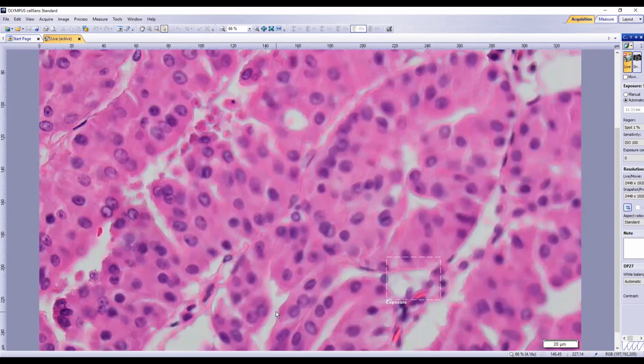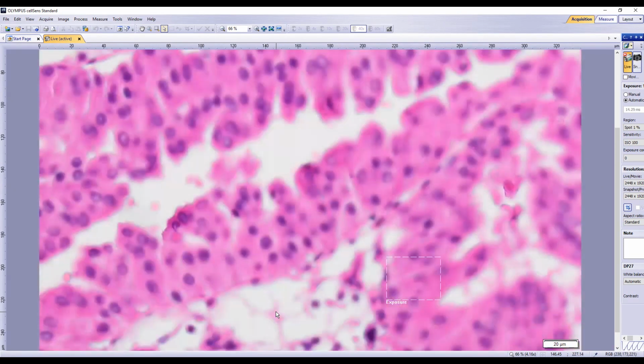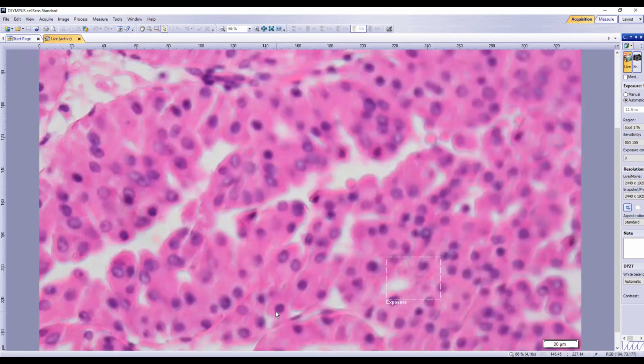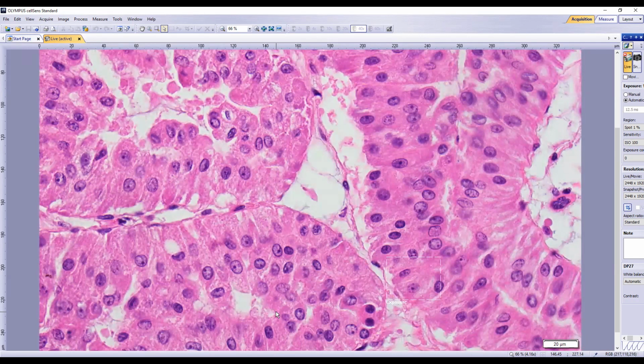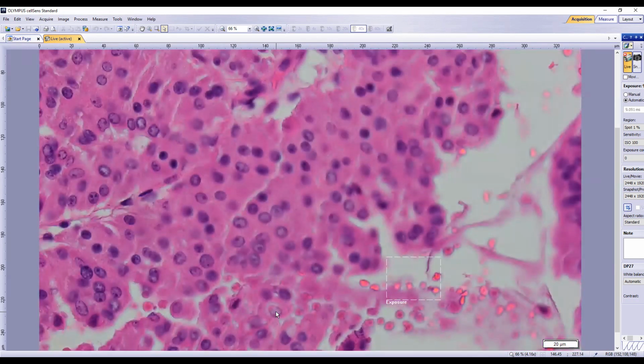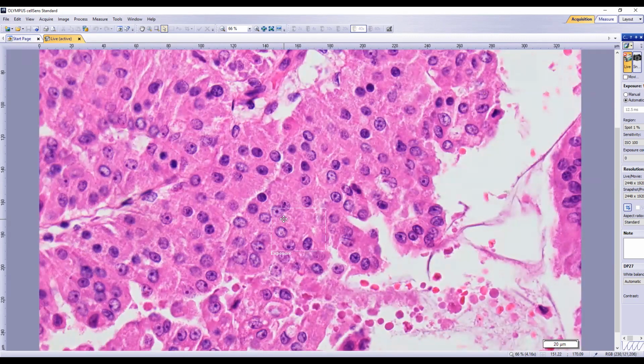The reason they made this into an independent entity is because they found an entity-defining mutation or translocation in these. They noted that a number of cases have the translocation partners DNAJB1 with PRKACA, and that's something that you see with fibrolamellar HCC.